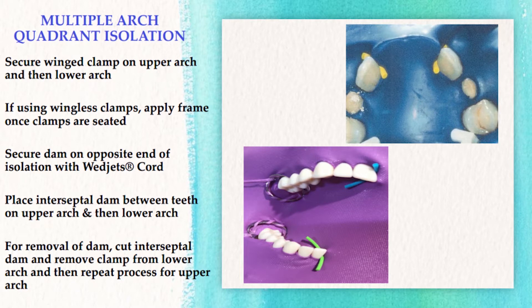The next step is to place the interproximal dam between the teeth, starting with the upper arch and then moving to the lower arch. When removing the dental dam, reverse the procedure: remove the wedget cord from the lower arch, cut the interproximal dam, remove the clamp; then go to the upper arch — remove the wedget cord, cut the interproximal dam, remove the clamp. The dam and frame come off together; if you're using the flex-a-dam, the integrated frame will simultaneously come off with the dental dam. Always check for missing pieces.